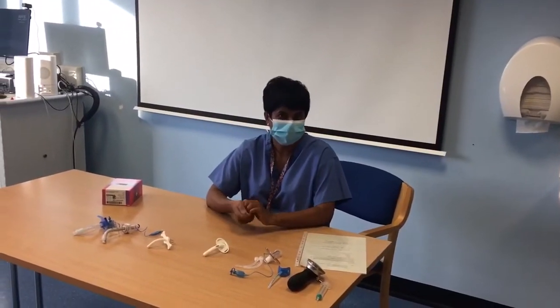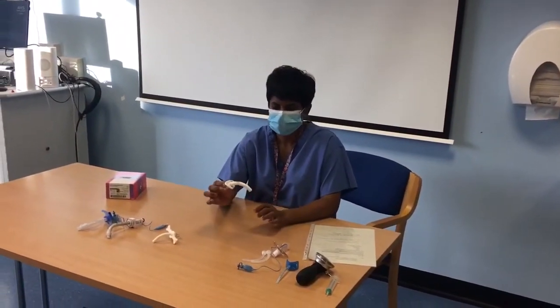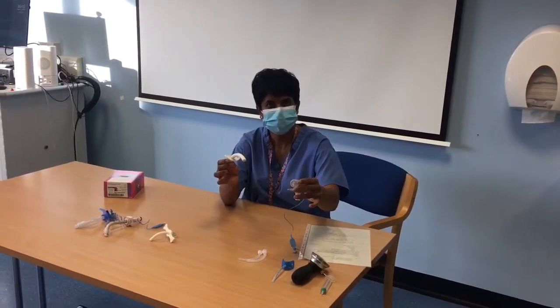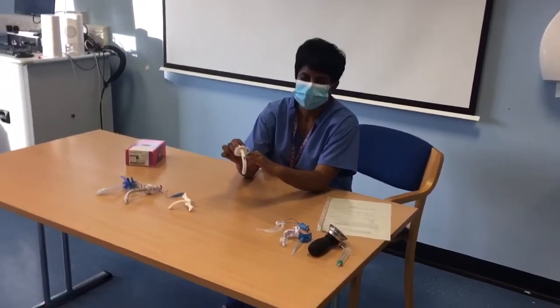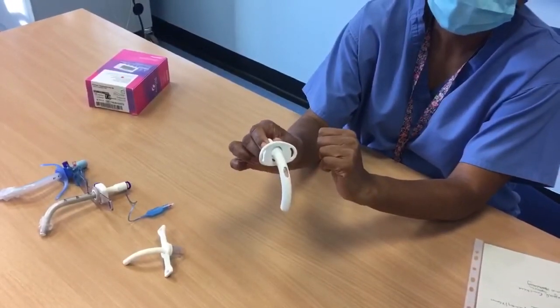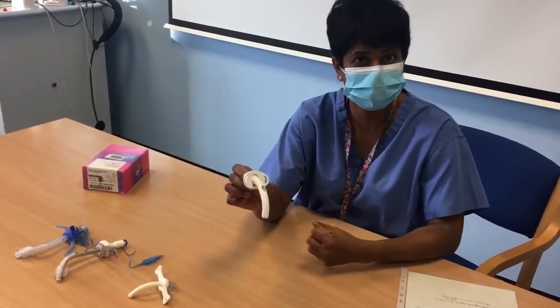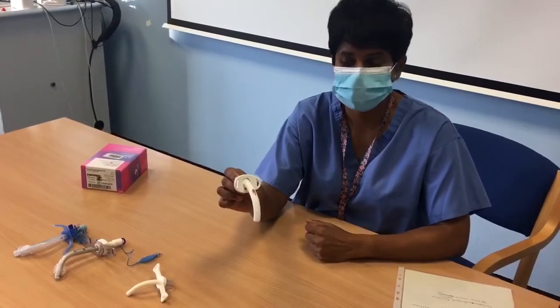Okay, so the next tracheostomy tube we're going to look at is the Shiley tracheostomy tube. Now, as you can see, there's no pilot balloon in here, because there's no cuff like our Portex tube, which would create a seal. You'll notice also on our Shiley, there's a hole, if you like, in our tracheostomy tube. This is a fenestration. This allows air to reach the vocal cords and allows the patient to speak. So we'll see these tubes mostly in our patients that we're weaning and wanting them to speak.